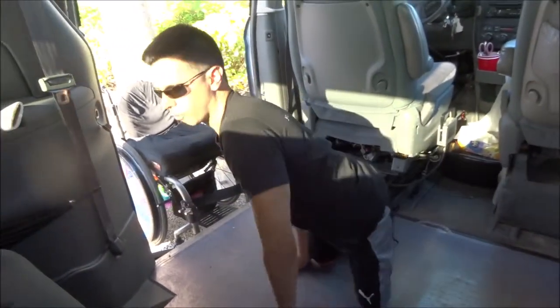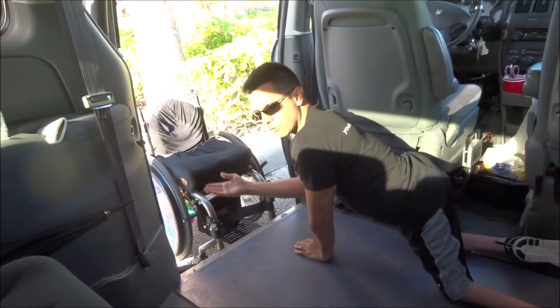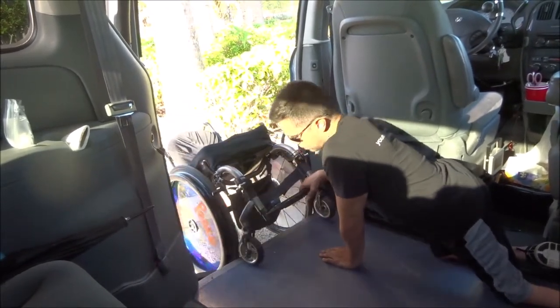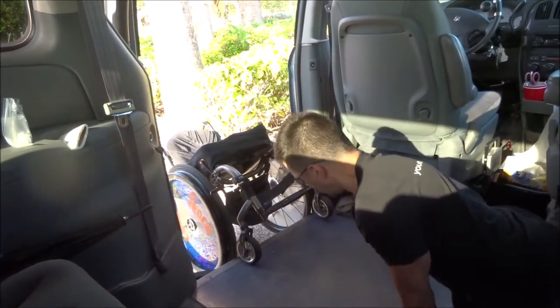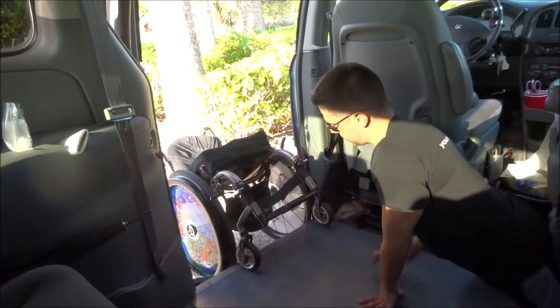First step is getting into the van myself. Then it's basically the reverse of what I did in the last video. I'm going to get the front casters up onto the van. Then I'm going to move myself back so that I can get enough leverage to pull this in.